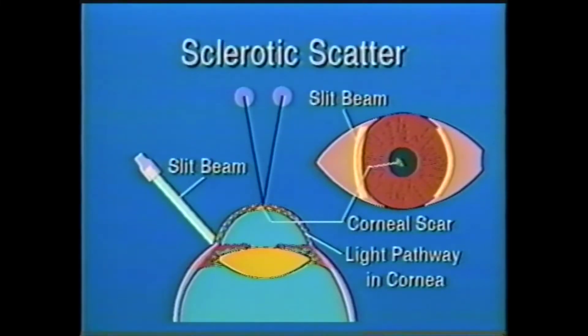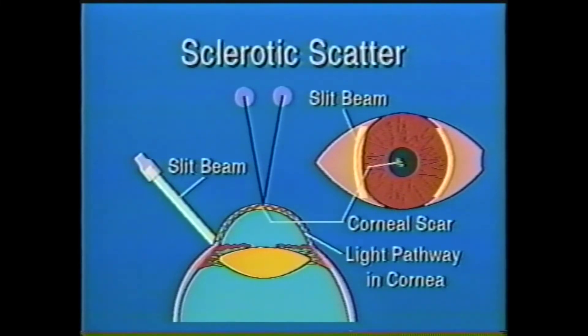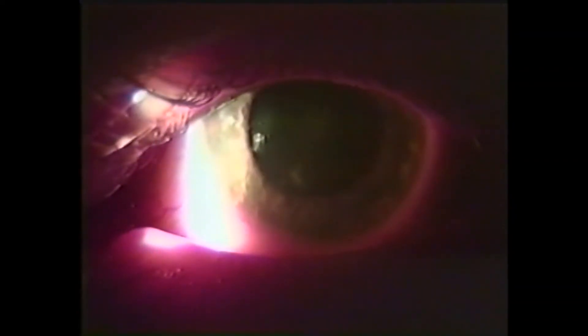Sixth and last, sclerotic scatter. This uses a light source that is decentered and defocused, that is no longer parfocal with the microscope. The slit beam is aimed at the limbus or the edge of the cornea, while the microscope is focused on the cornea. This maneuver is very useful in picking up fine abnormalities of the cornea, such as these corneal infiltrates.